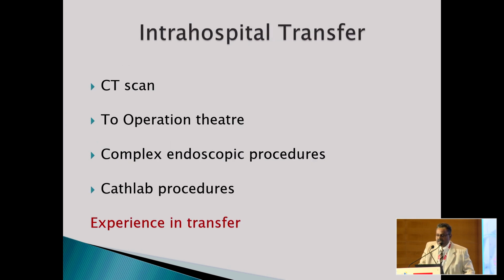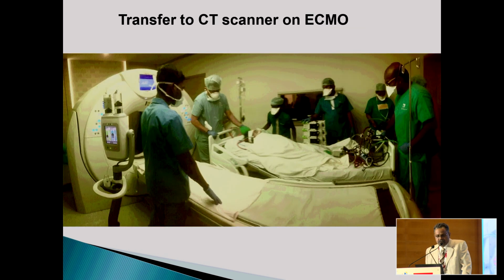First, we started with the intra-hospital transfer. This helped us a lot to gain experience in transferring the patient from one part to the other. So we transferred patients to the CT scan, to the operation theater, for complex endoscopic procedures, and to the cath lab. Here is a patient who got transferred to the CT scanner. Transferring a patient within a hospital is a little different from transferring from one hospital to another, because these patients are going to lie in the bed where they are managed. It's a little bit easier, but it is also riskier.